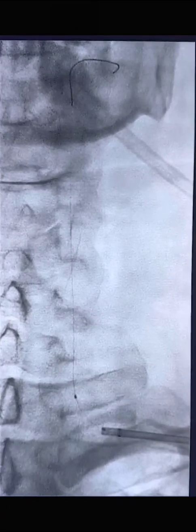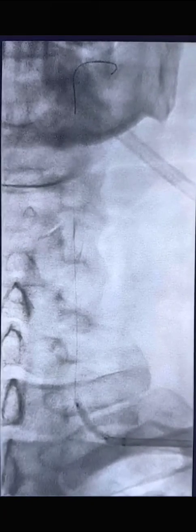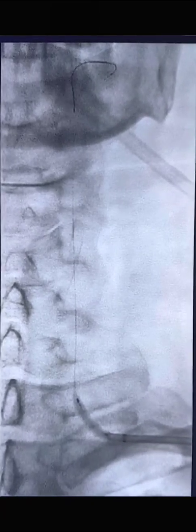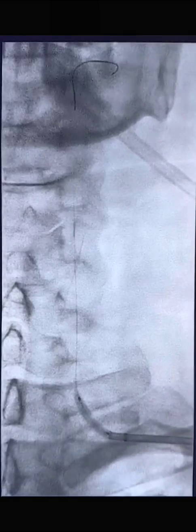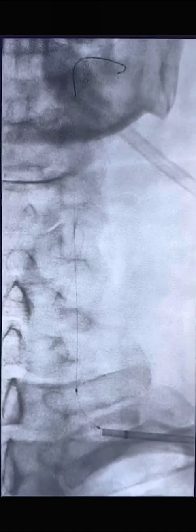A 3 mm balloon angioplasty was performed. A 5 x 15 mm balloon-mounted stent was then deployed across the stenosis with good antegrade flow across the ostium.